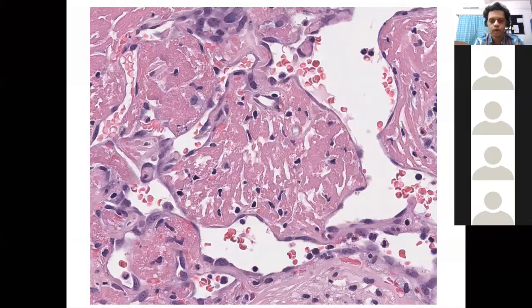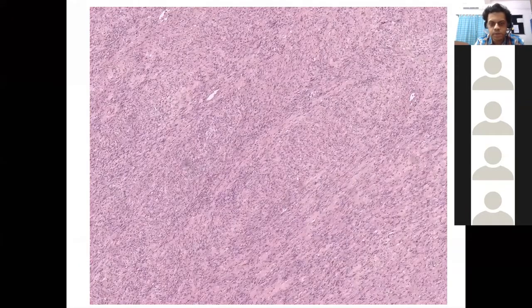Yes, sir. Okay. So the organizing thrombus has been seen, but remember that sometimes even in the Antoni A area, you won't get Verocay bodies. Instead of that, what you will get is long fascicles which are intersecting with each other, where you will not have much of a clue as far as the Schwannian nature is concerned, because you are not getting to see Verocay bodies. So that's also common. Cellular schwannomas are known to exist where you don't get much of Verocay body formation.